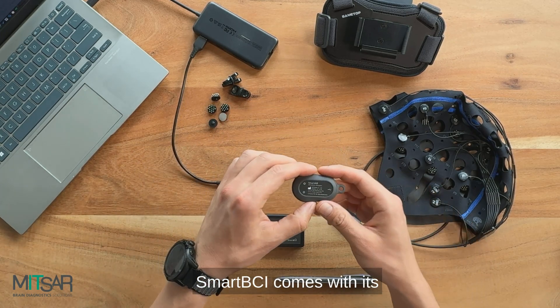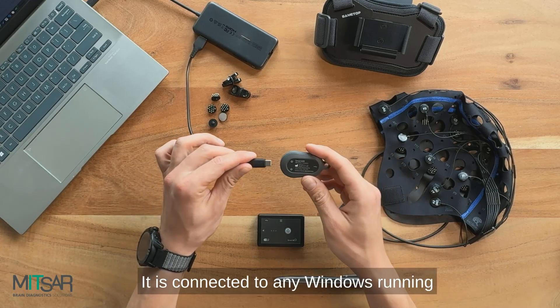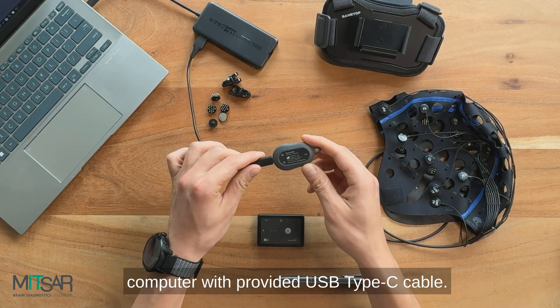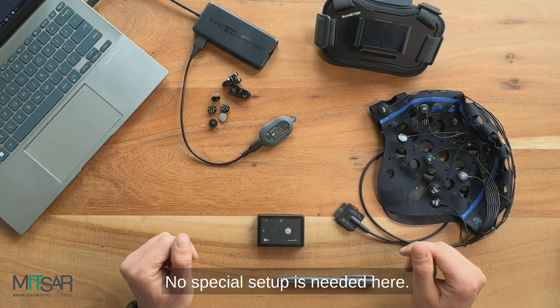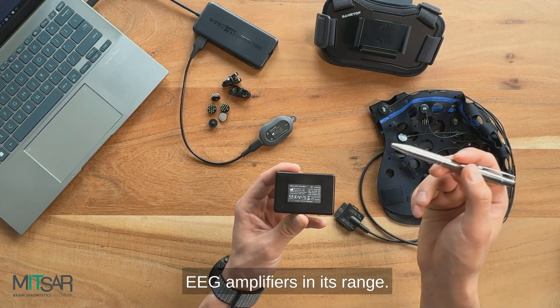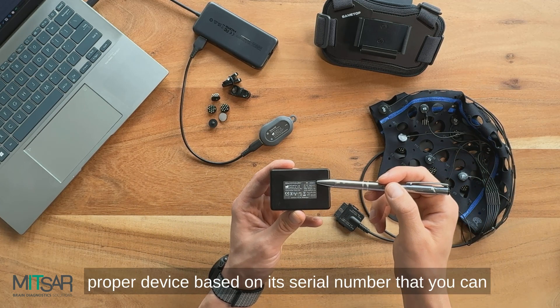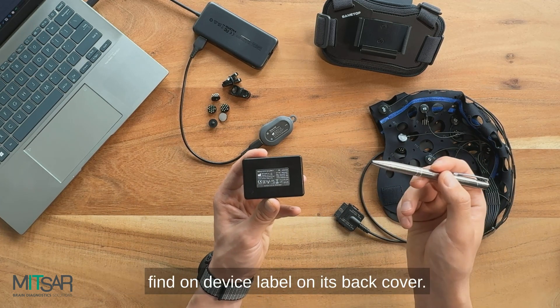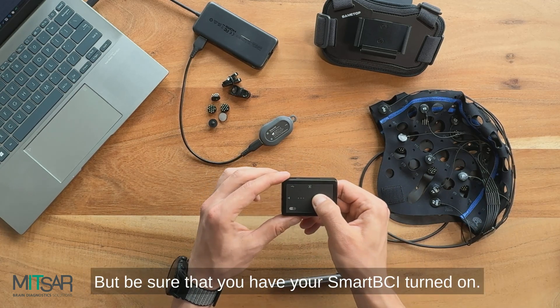Smart BCI comes with its own wireless adapter, Smart Air. It is connected to any Windows running computer with the provided USB Type-C cable. No special setup is needed here — it will automatically detect all EEG amplifiers in its range. You just need to select the proper device based on its serial number, which you can find on the device label on its back cover, but be sure that you have your Smart BCI turned on.